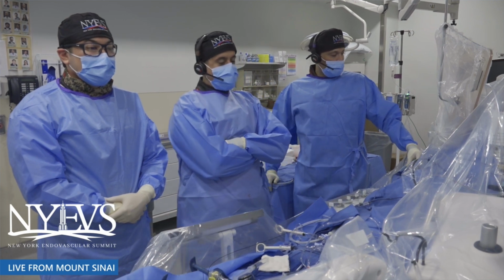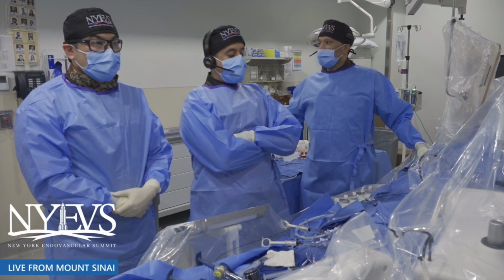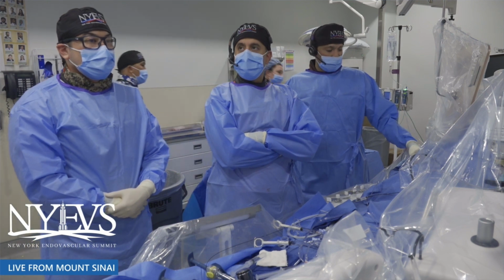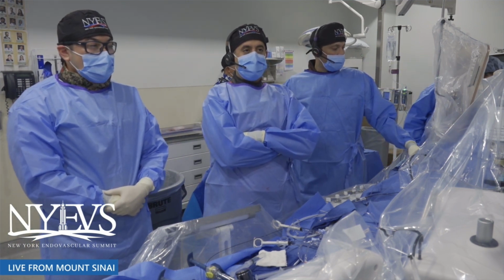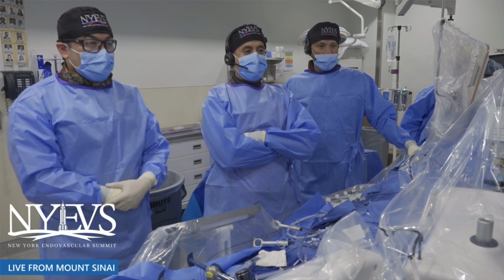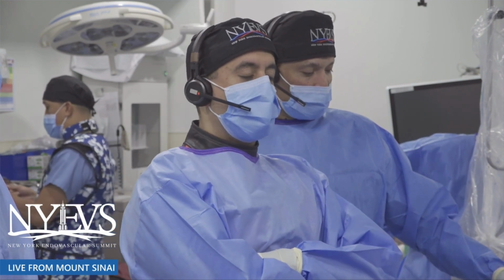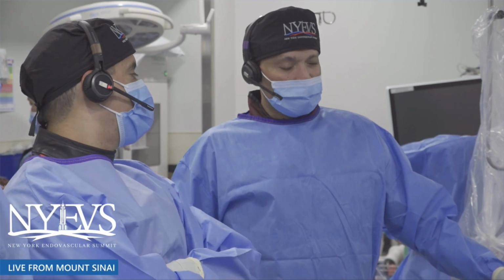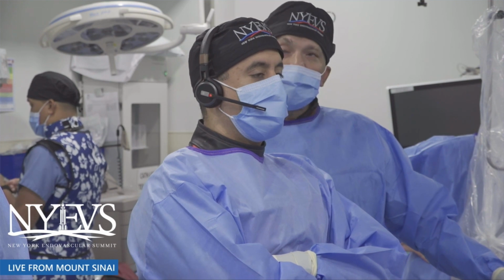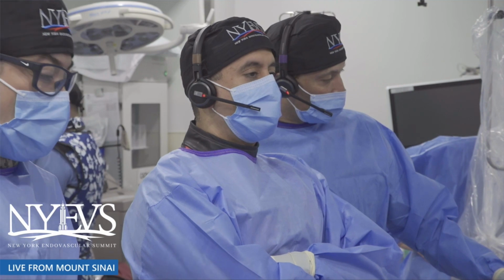But that brings up the question of whether you should be using shockwave in this as well. Yeah, so that's a different argument completely, because I don't think we've studied that either, right? I do believe that shockwave does improve the safety of the procedure because you're changing that morphology. People who end up with indiscriminate ballooning or stenting end up with a big perforation afterwards. We see those classic pictures, but a lot of those were pre-shockwave. So it is possible that you can make the vessel more compliant, make it safer to expand, and that could potentially change the whole nature of the case. But we don't really know that yet. And you have the added cost there, of course, but there is reimbursement.